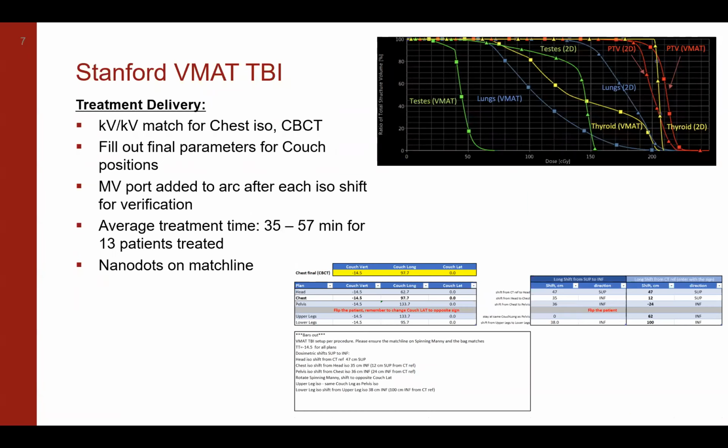So as you can imagine, because we're using VMAT as compared to our traditional APPA 2D technique, shown in the figure at the top right, we can simultaneously provide significantly better sparing to organs at risk, while also improving the coverage and conformity to the target structure.